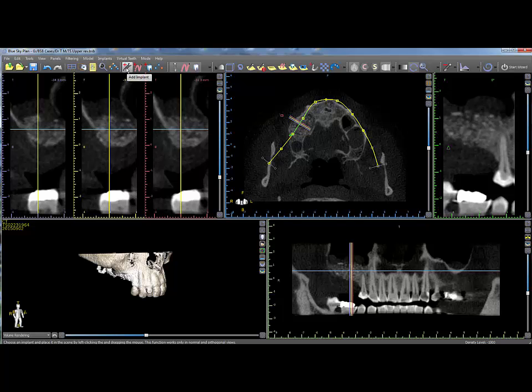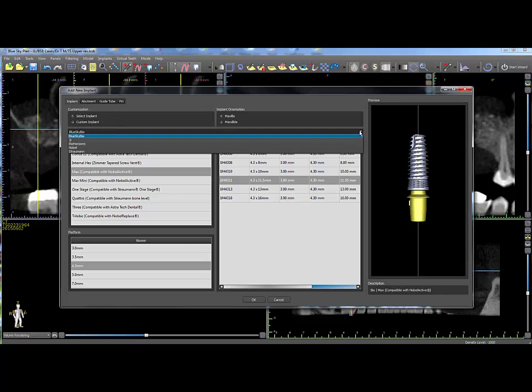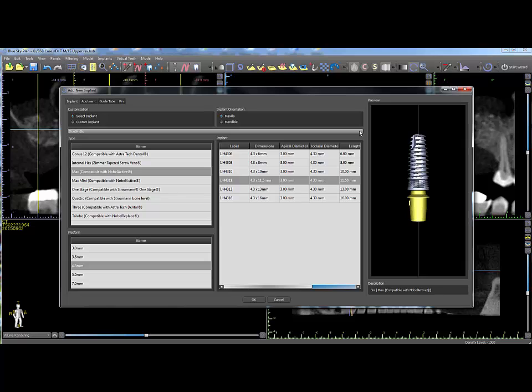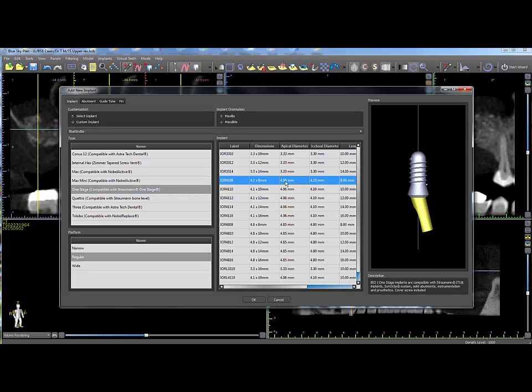To add an implant, click on the Add New Implant icon. From the window, select the manufacturer from the drop-down, choose the type, platform, and the implant.